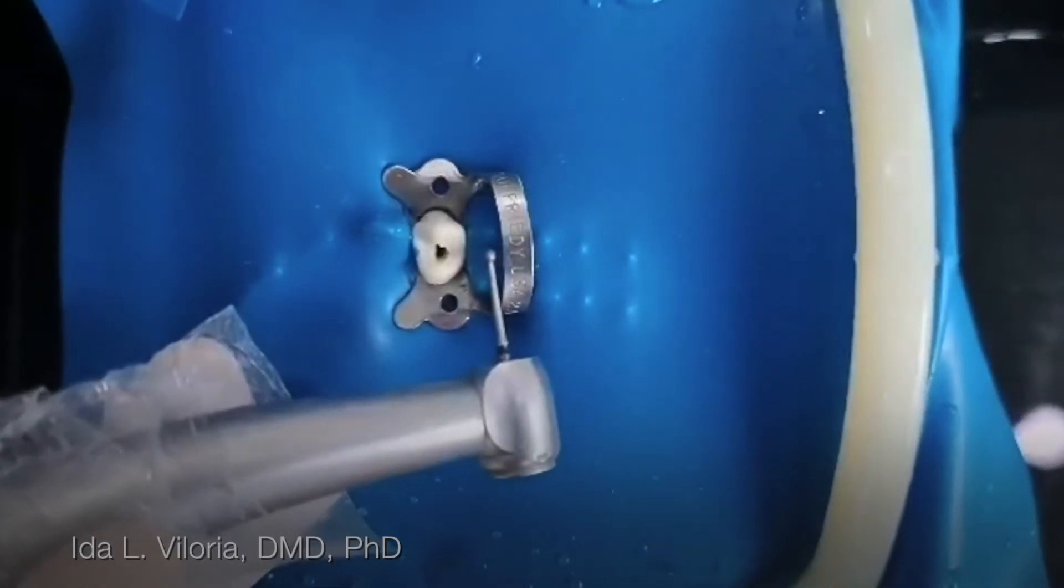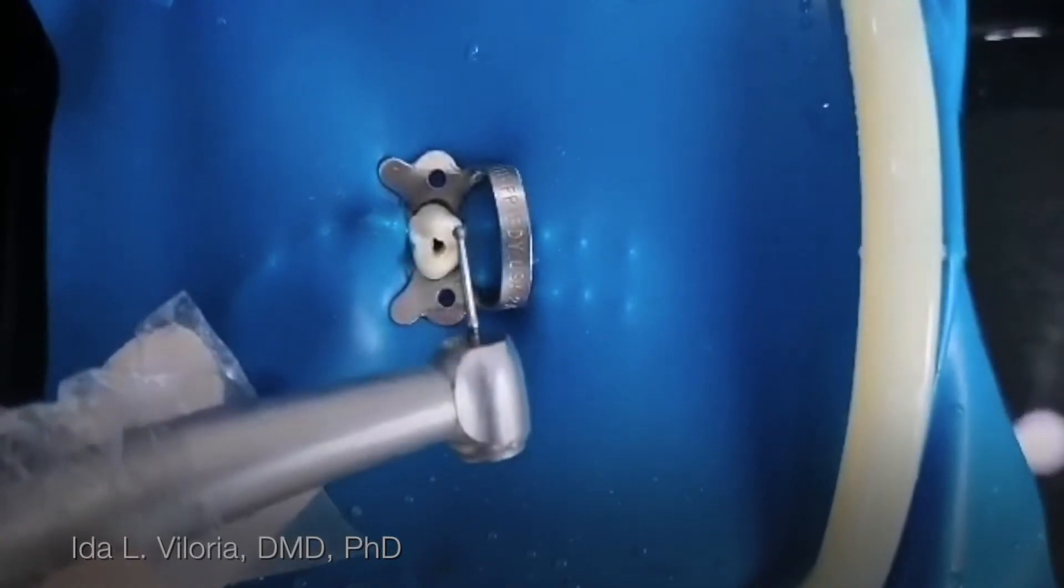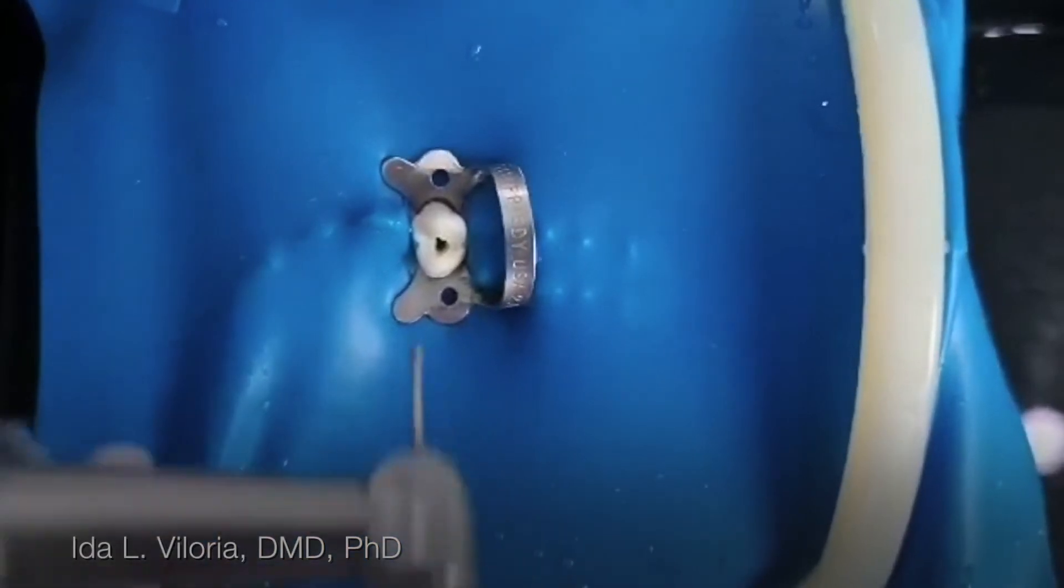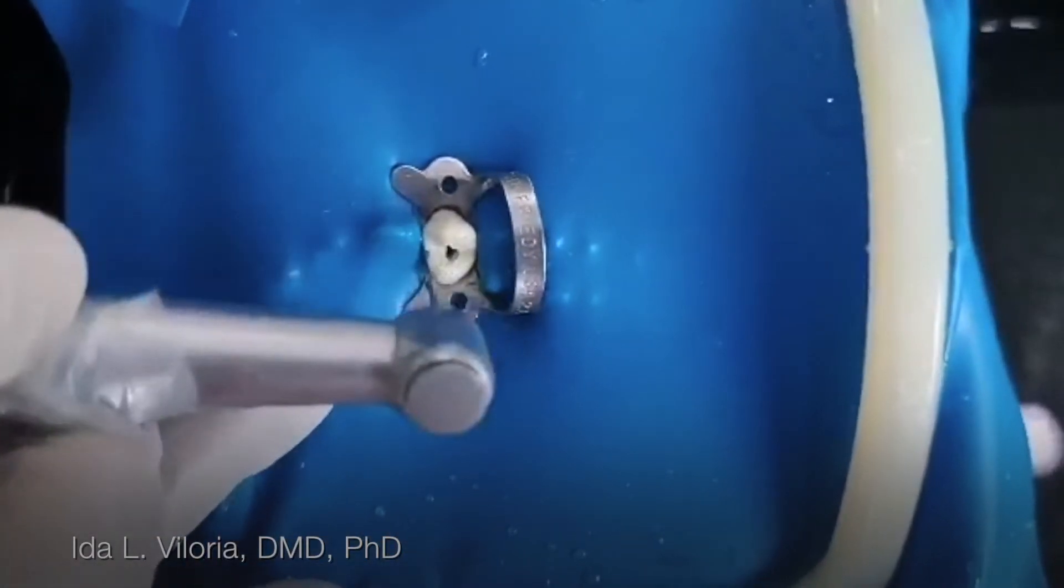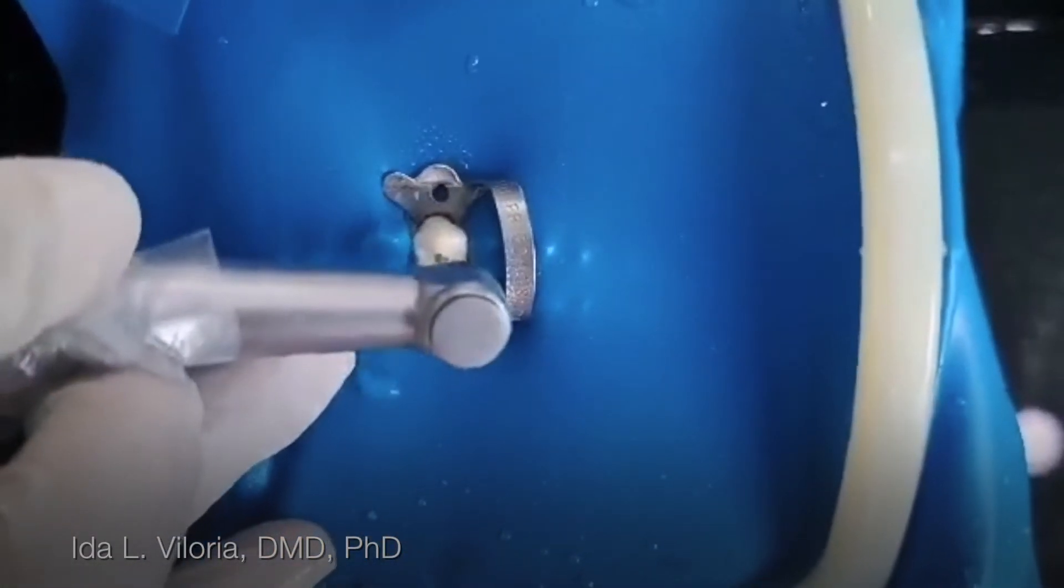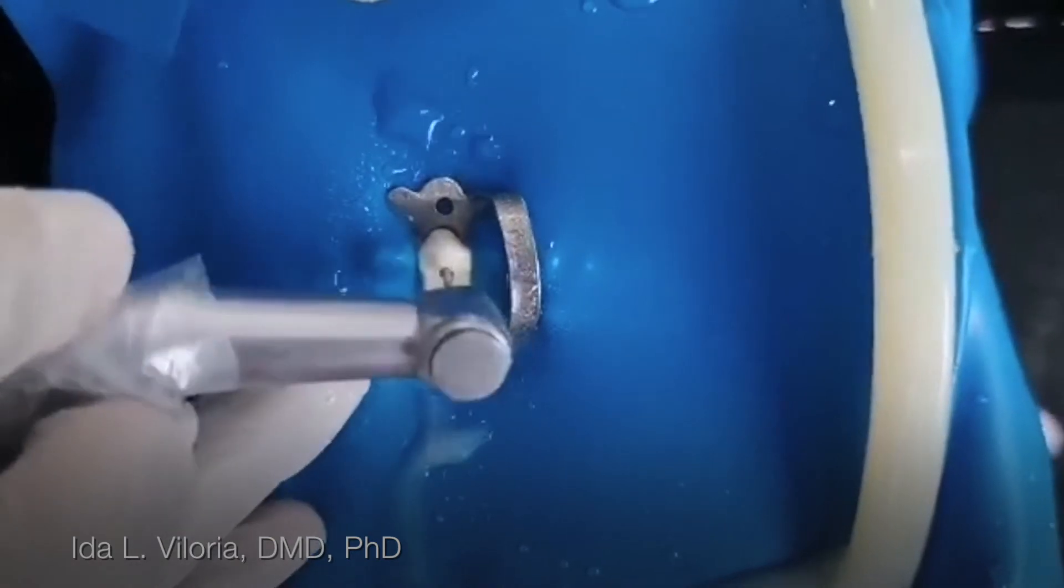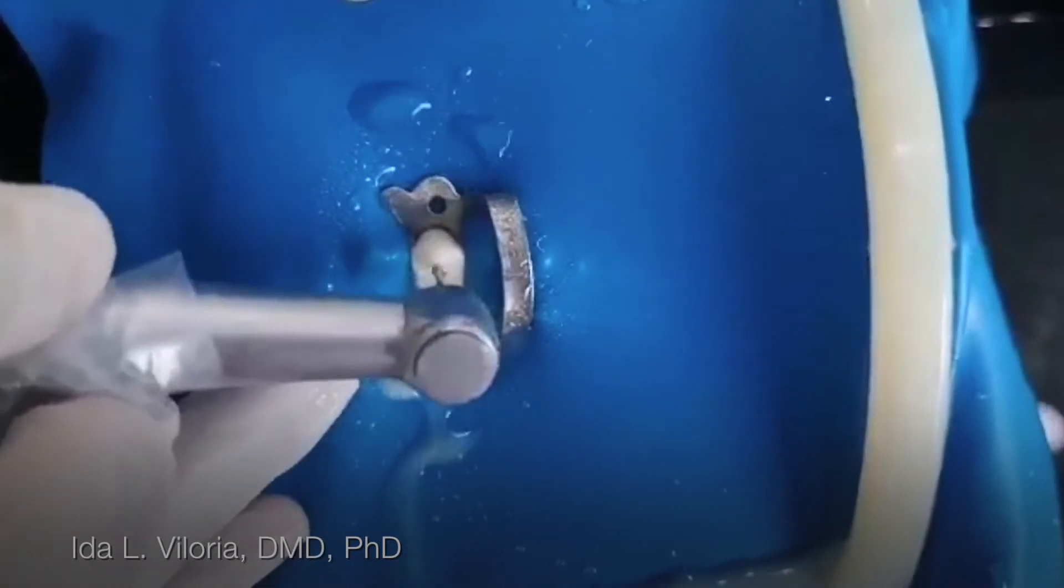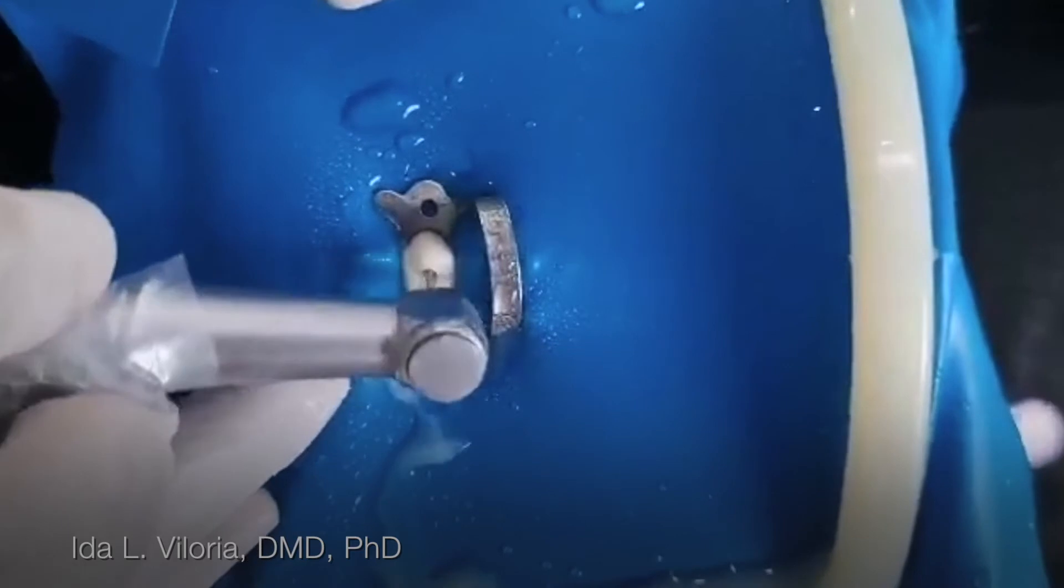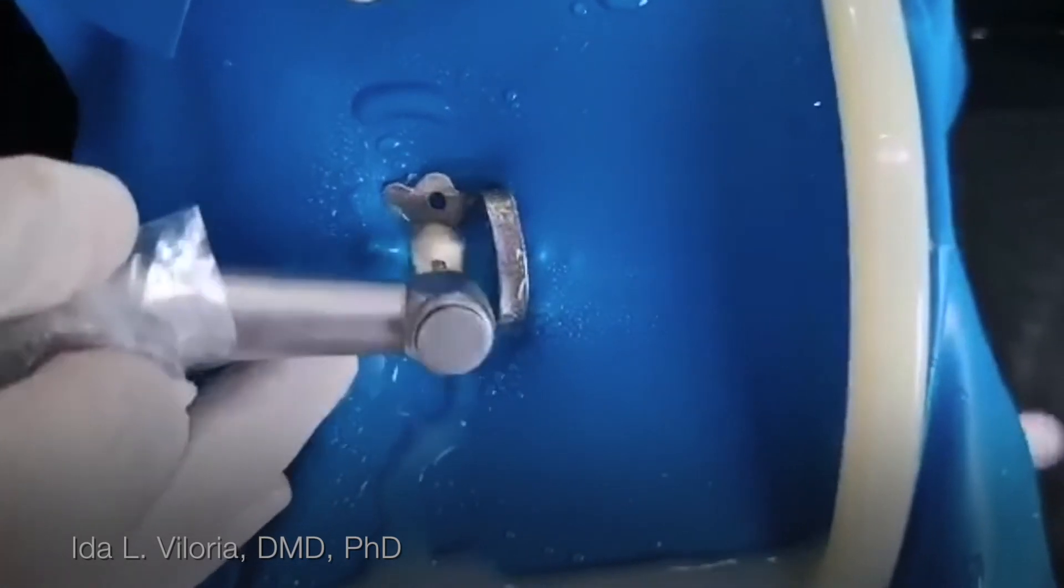I still have to continue, but I have changed my roundburn long chunk into a bigger one because it can now get in. So I'll start. I'm now removing the roof of the pulp chamber towards the buckle, then towards the palatal.